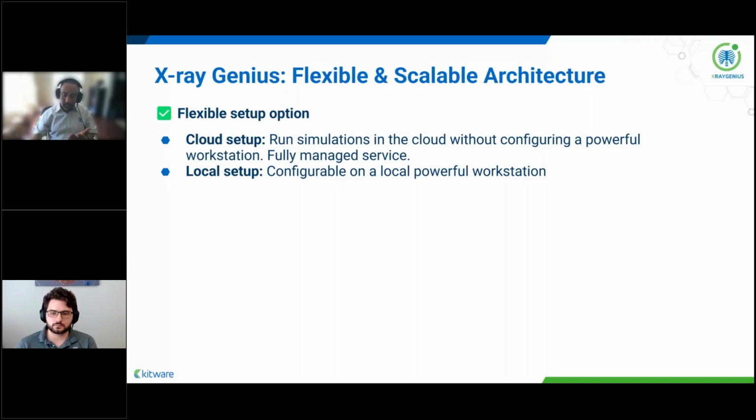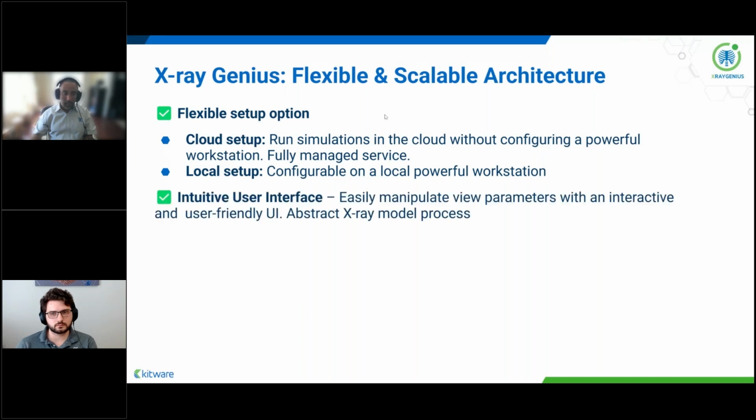In fact, the X-Ray Genius demo that we'll show today is a managed service, and you'll have an option of configuring X-Ray Genius locally if you have a powerful workstation.